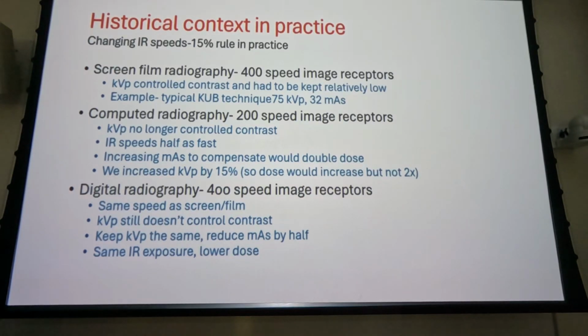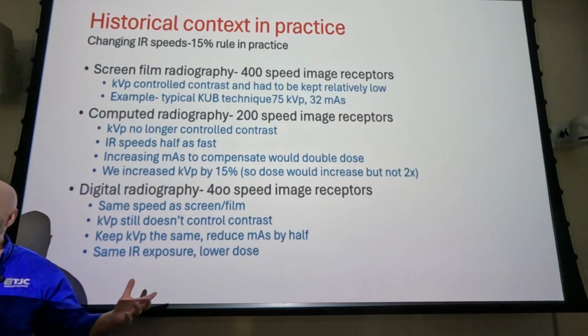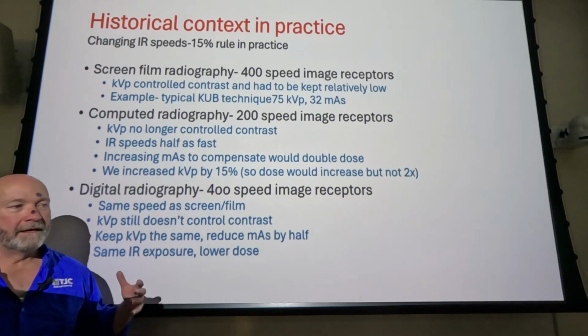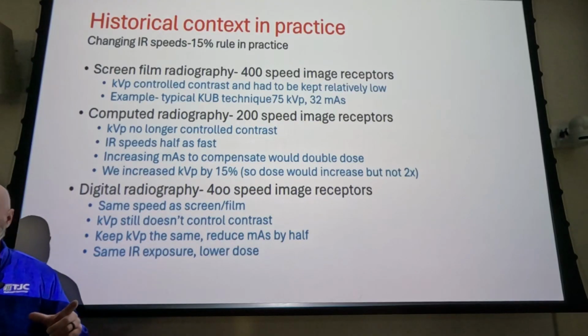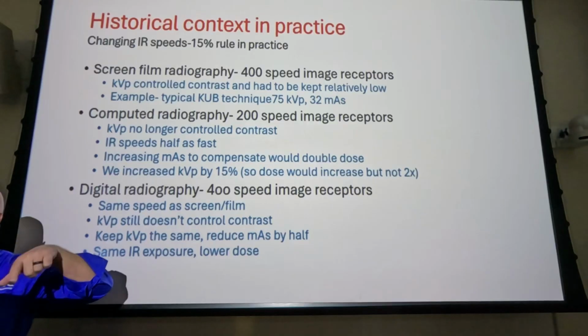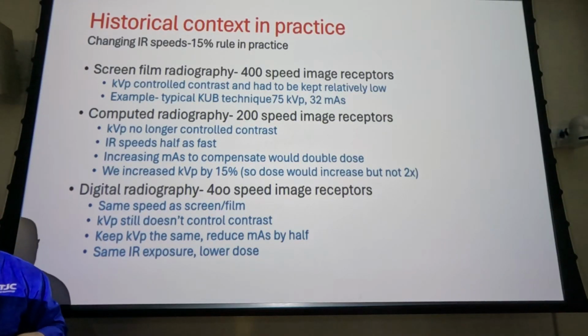We're going to get to it. Lookup table. So you got two computer algorithms, kind of playing side by side here. You make an exposure, and you get a range of densities on your image. Okay, but inside of the computer is another computer algorithm that has the ideal look for that exam type. So let's say you shot a hand, or anything, it doesn't really matter. And if you could get into the computer algorithms, what you'll see is they're kind of a table, and they've got all these lines that go up and down, and that determines contrast and density.